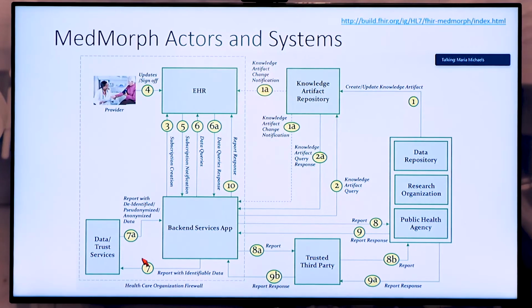In this scenario, FHIR is used for interactions with the EHR, such as notifications to and queries from EndoVault, as well as sending information to other entities like the State Cancer Registry or NCHS.